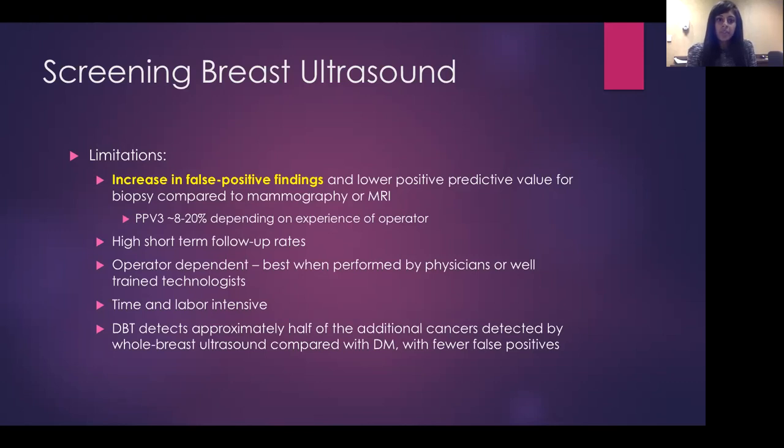Ultrasound is operator dependent. So it's best performed by physicians or well-trained technologists. So this really limits who is able to perform this type of study. It is time and labor intensive. And 3D mammography detects approximately half of the additional cancers detected by whole breast ultrasound and has fewer false positives.